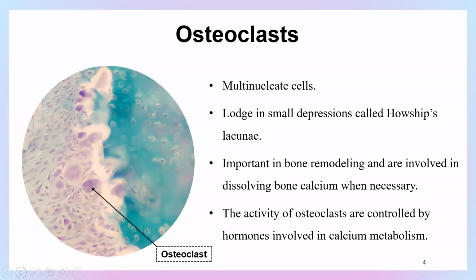So here, this slide is specially made to look at osteoclasts. You can see several osteoclasts actually, and you can see the other cells also. But here, this is an osteoclast, and you can see that it is inside this cave. You can see several nuclei inside.